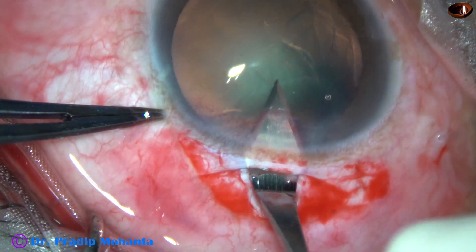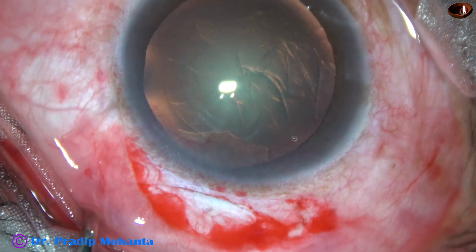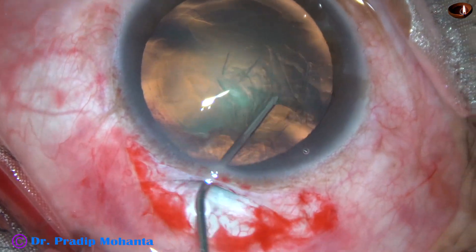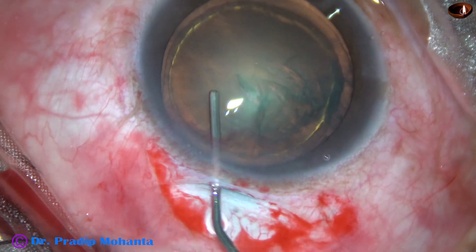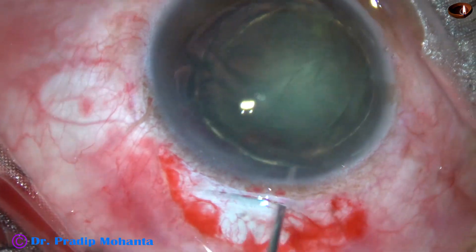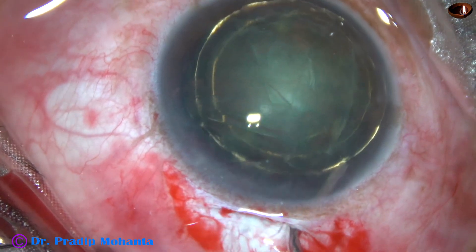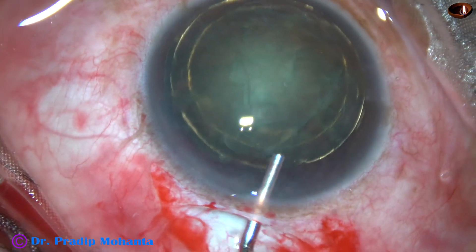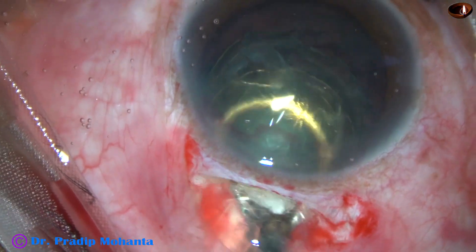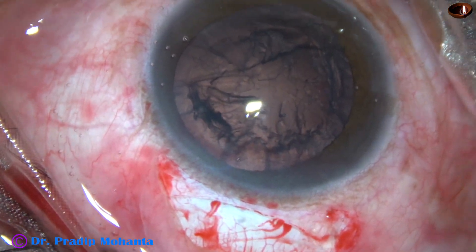The tunnel is opened. Hydrodissection is done, and hydro delineation is also done. By the hydro cannula itself, the nucleus is prolapsed, and then visco is injected both in front and behind the nucleus. An irrigating vectis removes the nucleus. The epinucleus is also removed.